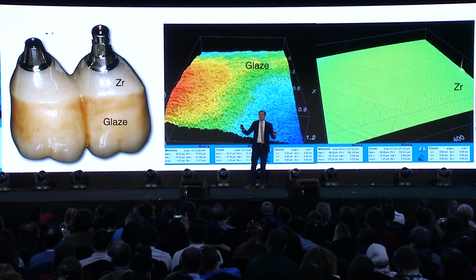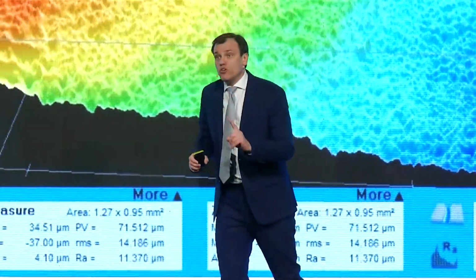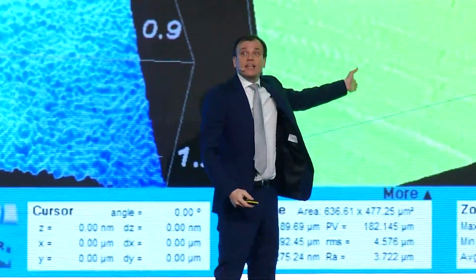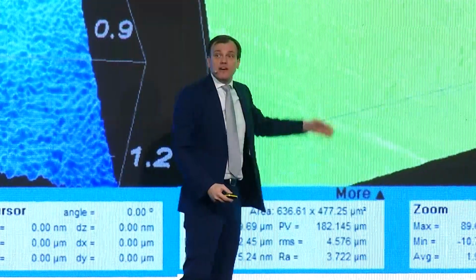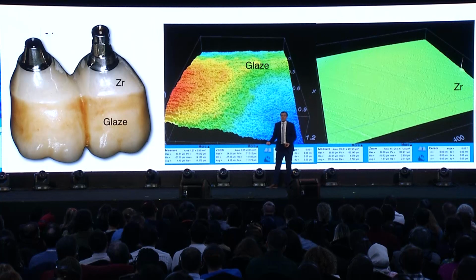Once we know that protection, first line of defense is epithelium, so for epithelium, zirconia is much, much better to adhere than rough surface of the glazed material.